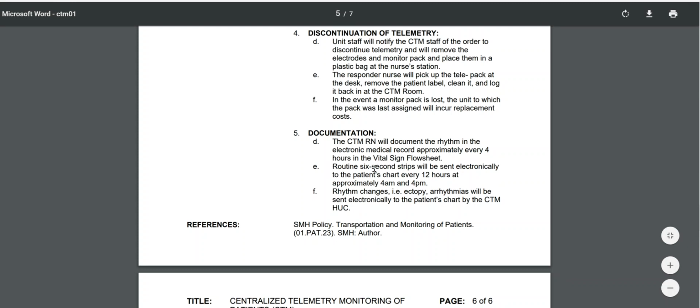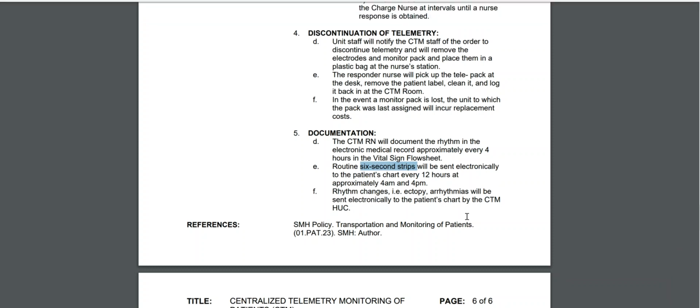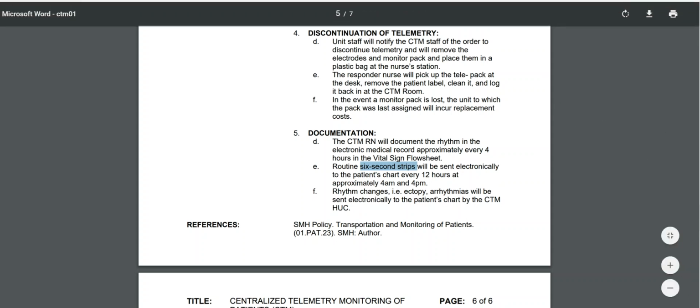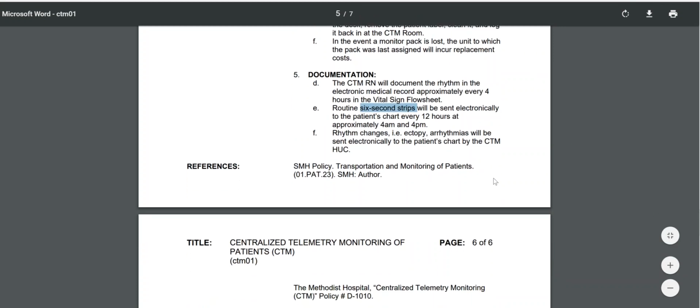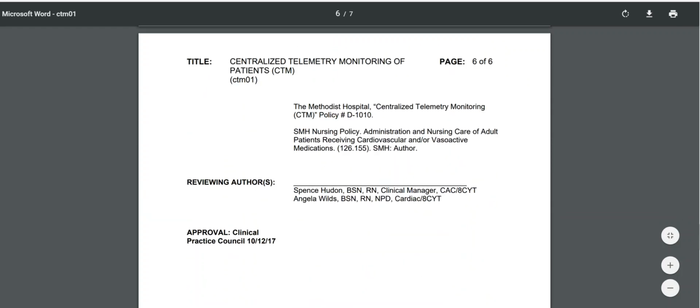You will learn specific dysrhythmias that you might see on NCLEX, and we're going to learn to recognize the pattern of those dysrhythmias looking at a 6-second strip. And we know that the telemetry nurse is responsible for recording that information in the client's chart and monitoring how that changes over time. So that is routine telemetry protocols.